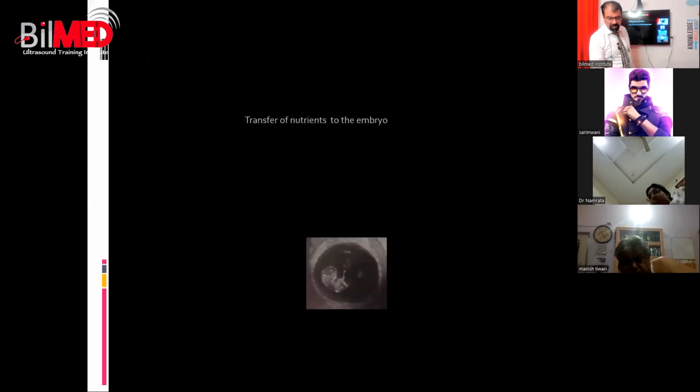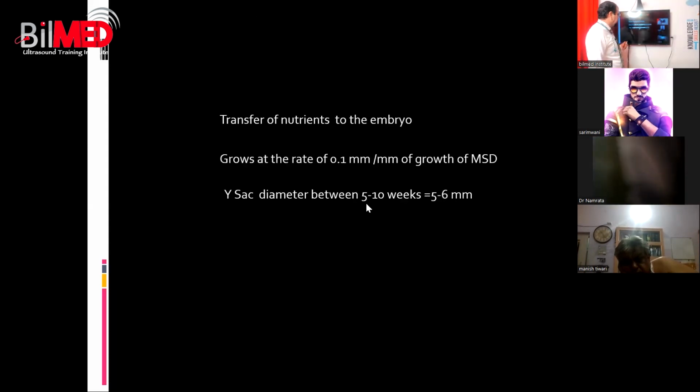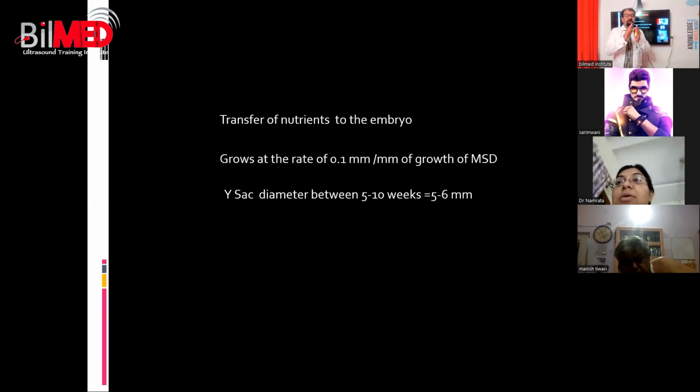Now, how much is the yolk sac? Yolk sac diameter between 5 to 10 weeks is 5 to 6 millimeters. So roughly it is about 5 millimeters. Yolk sac should not be big enough. It should not be very small. If it is very small, we will come to that.